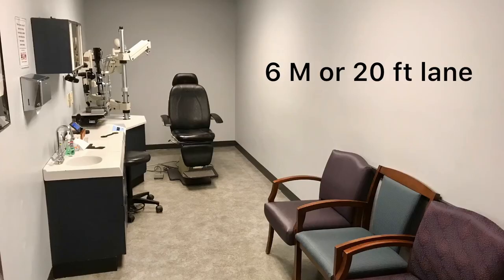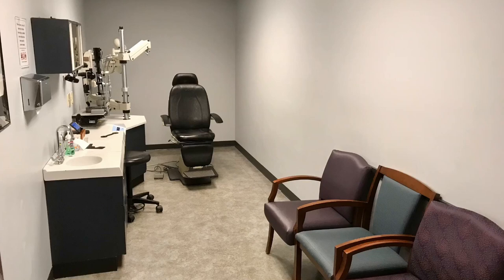The first thing I'd like to discuss is basic room setup and what the fundamental pieces of equipment are that you should have in the room to perform all elements of a comprehensive examination. Ideally, the room length will be longer, 6 meters or 20 feet. This is particularly helpful when performing strabismus measurements for conditions such as exotropia.